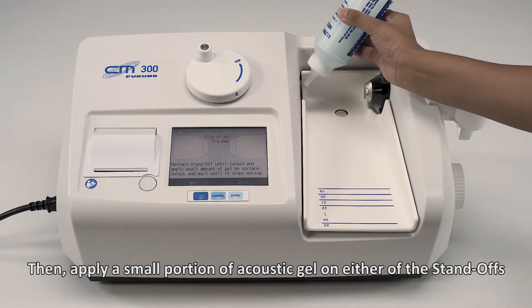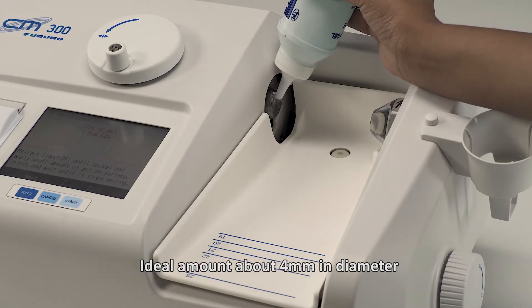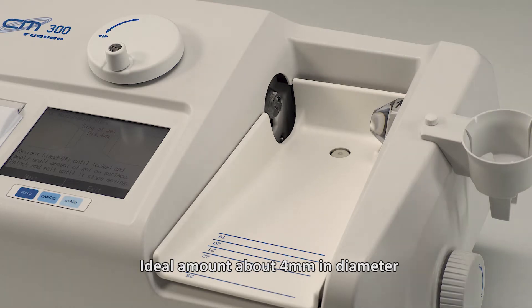Apply a small portion of acoustic gel on either side of the standoffs. Note the ideal amount is about 4 millimeters in diameter.